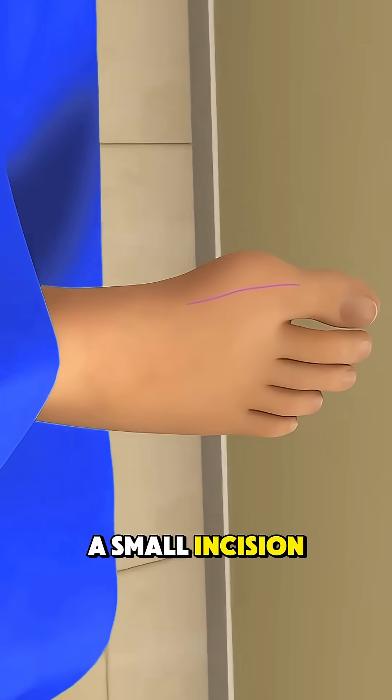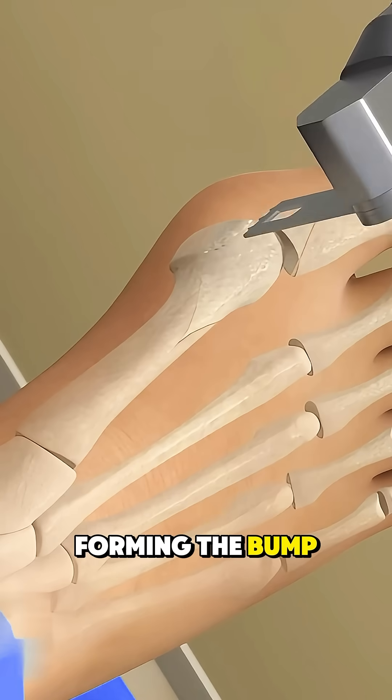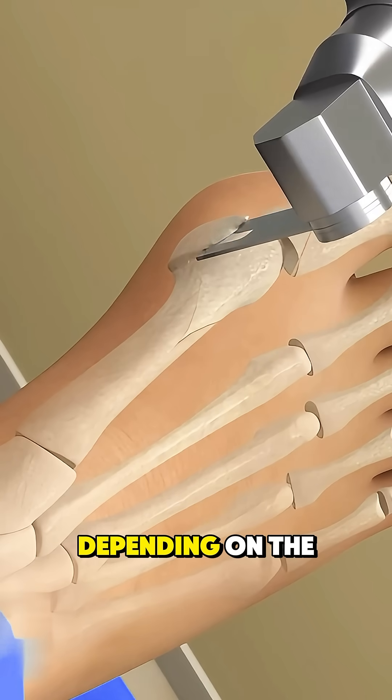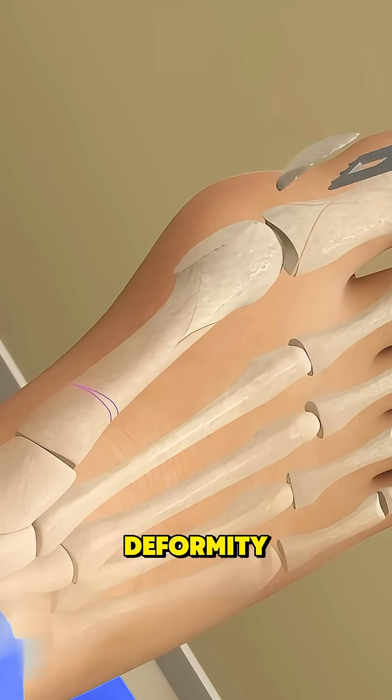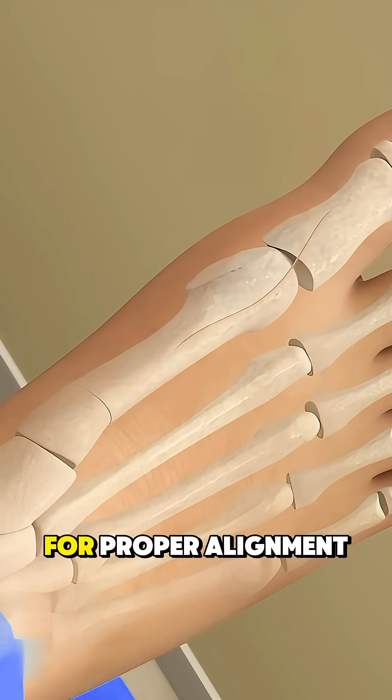The surgeon makes a small incision near the bunion to expose the joint. Next, the excess bone forming the bump is carefully removed. Depending on the severity of the deformity, the surgeon may also cut and reposition the bones of the toe for proper alignment.